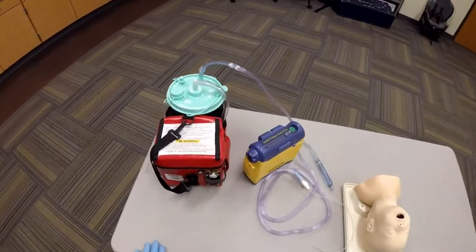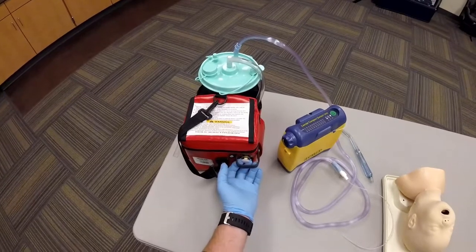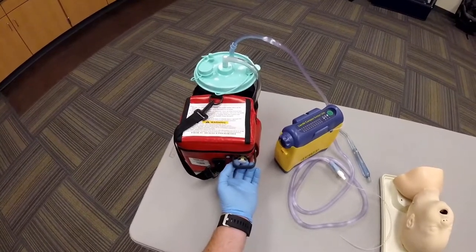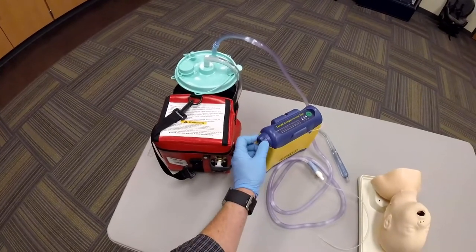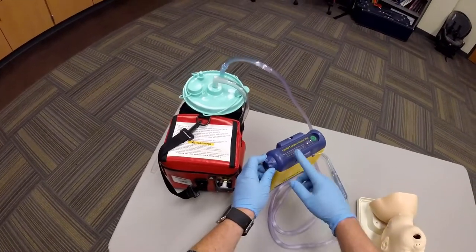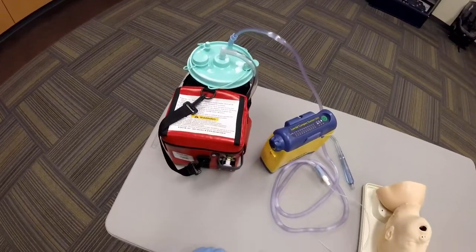300 millimeters is too much on a child. You can adjust the amount of suction by pulling this tab out or adjusting the knob to set it to anywhere from 60 to 100 millimeters of mercury.